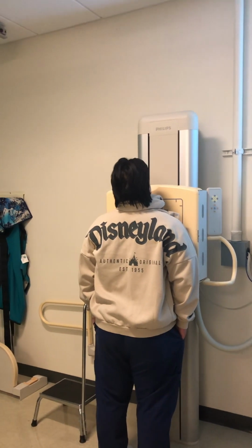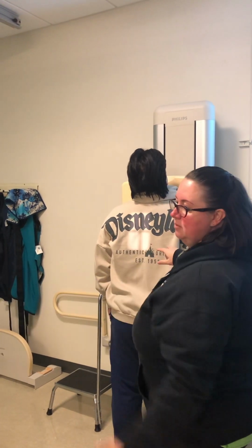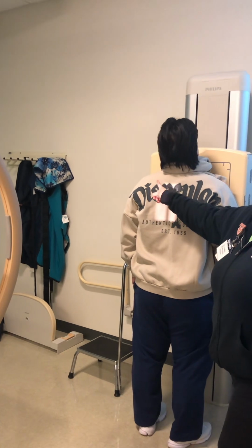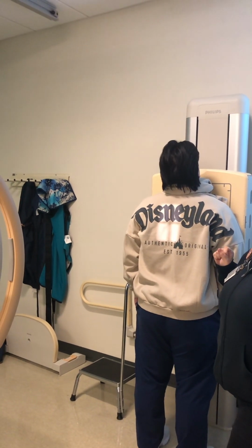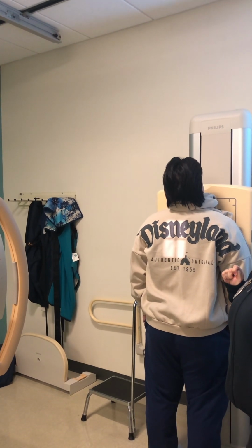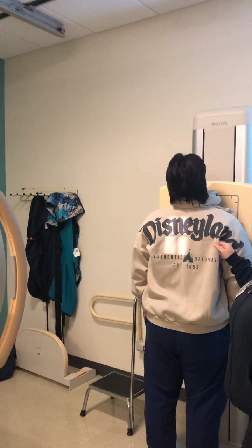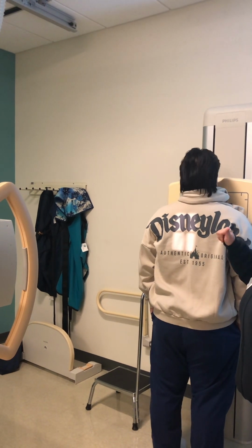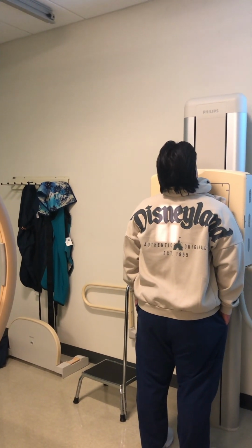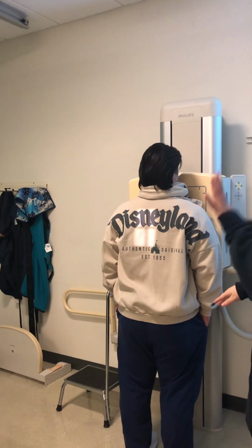Okay. Markers for this one. Forgot that I didn't have one. But it does not really matter whether you use the right or the left. Just make sure it is on the correct side of the body. Now, would you want it inside the bucky or on the board? Depends on your bucky and depends on your board. Okay. But on the board's probably safest. So, questions about sternum? So, lateral first, then the RAO.